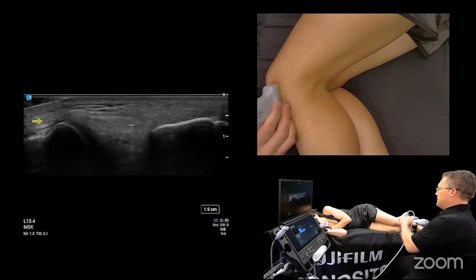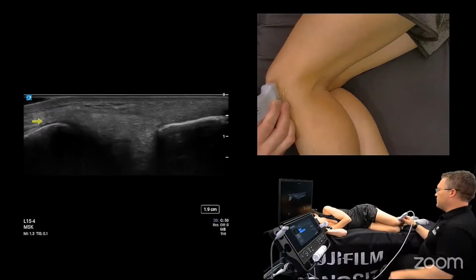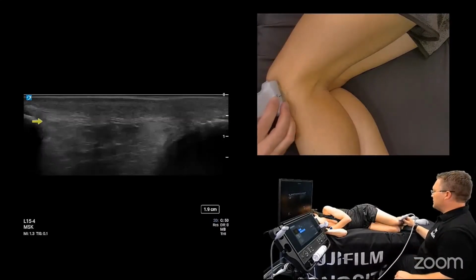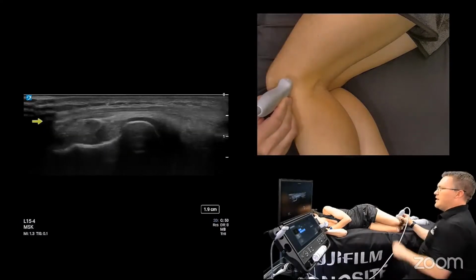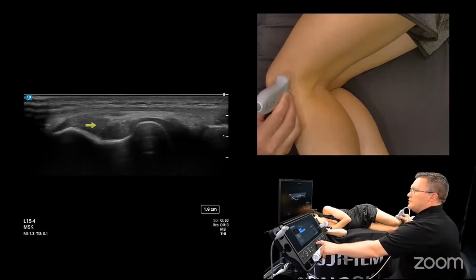But based on her presentation here, our model's knee is bent just close to 45 degrees. And I know the IT band is coming from the lateral thigh. So it originates out on the lateral ilium, and I know I need to point my probe that way to get it in its long axis, okay? So here we can see the IT band jumping over the popliteus groove, lateral epicondyle of the femur, and we'll get to that on our LCL.